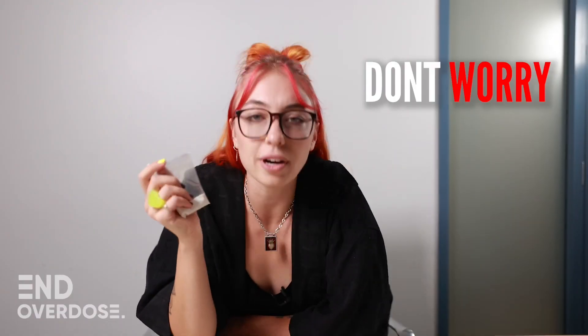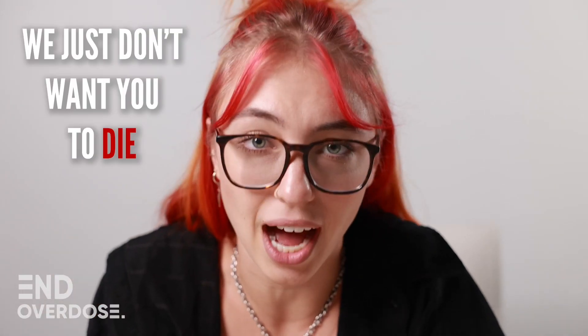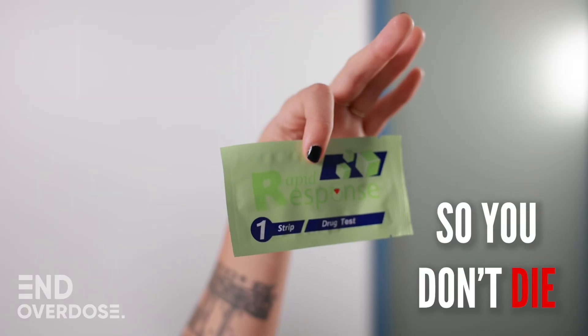You bought some drugs? Don't worry, we're not cops. We just don't want you to die. Here's how to use a fentanyl test strip so you don't die.